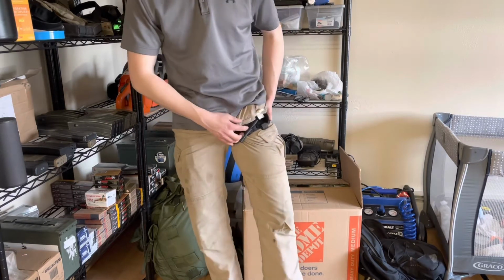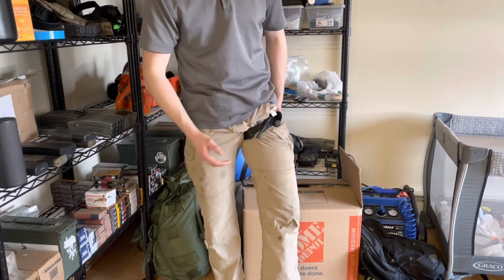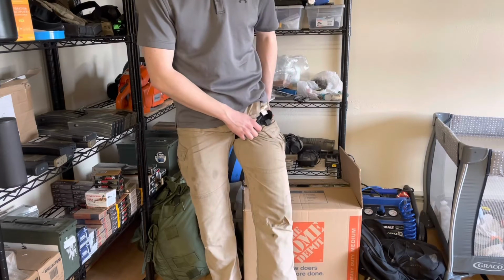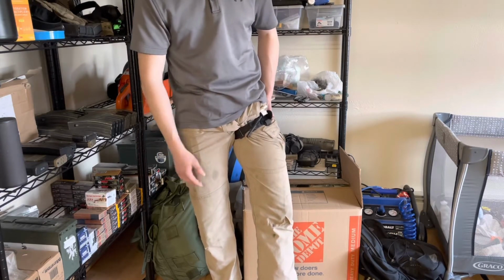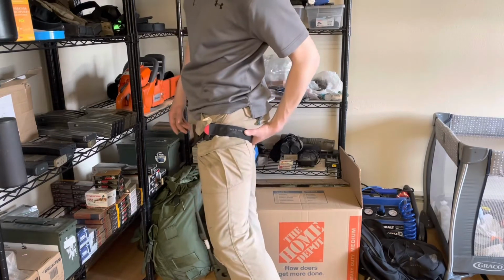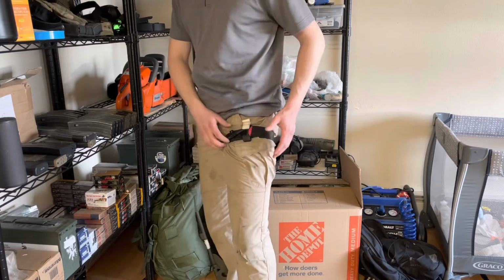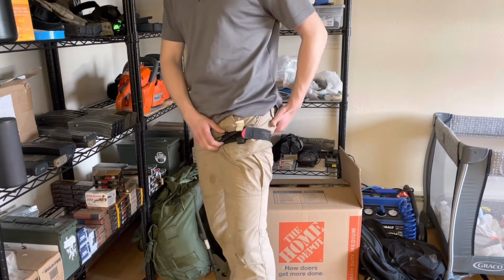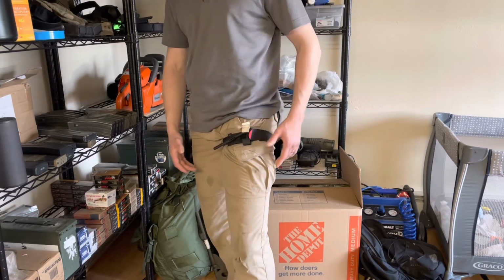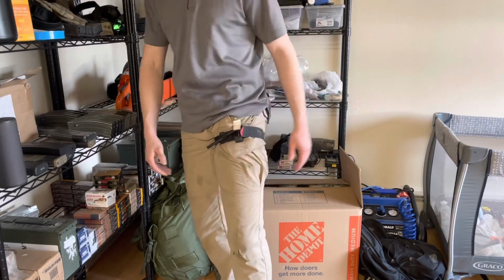It's not something you're going to easily replicate with like a belt. If you have it at all as a possibility to have a proper tourniquet, you should have a proper tourniquet. They're like $30. But anyway, you can see that the tourniquet is high and tight. It's as high on the leg as I can practically get without being on the butt, right? You want the tourniquet to be on the leg itself to make sure you're not going to have it slip off and be loose, right?